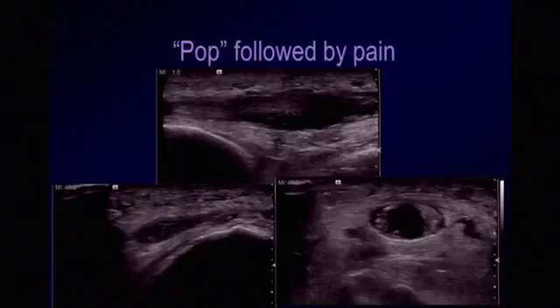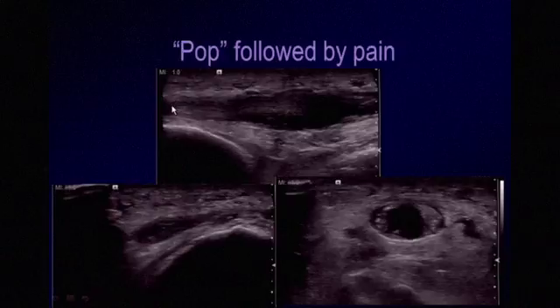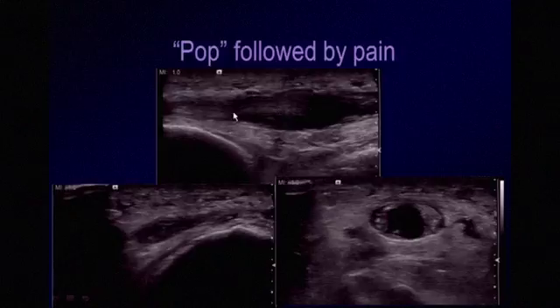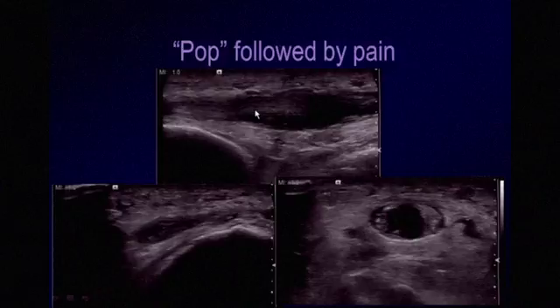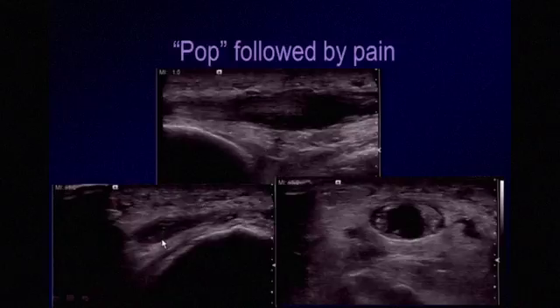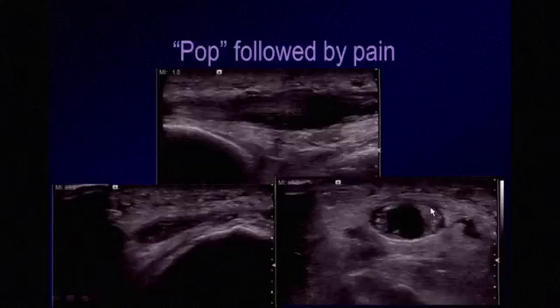This patient presented with a pop followed by pain in the anterior ankle. Scanning the anterior tibialis tendon, it is no longer extending across the joint but is retracted and somewhat wavy in configuration because it has lost tension. It is hypoechoic, and there is fluid in the tendon sheath. Distally, we find an empty tendon sheath, but scanning more proximally, we find the intact portion of the tendon.